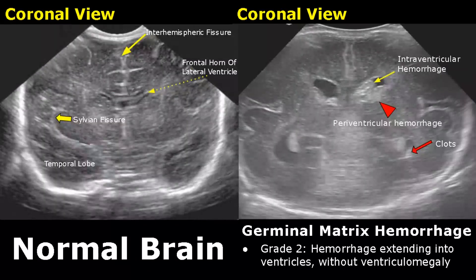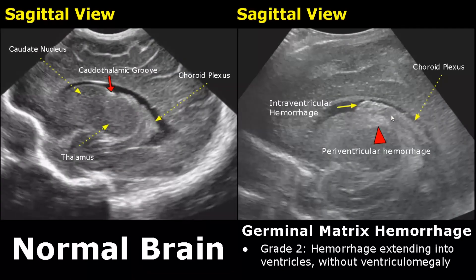In grade two, the hemorrhage will extend into the ventricles but without ventriculomegaly. There are clots outside and inside the ventricles. This is a sagittal view of grade two germinal matrix hemorrhage — we see clots inside and outside the ventricle.